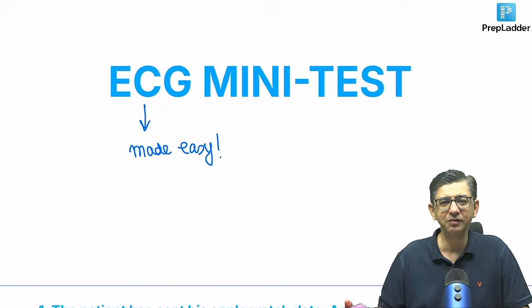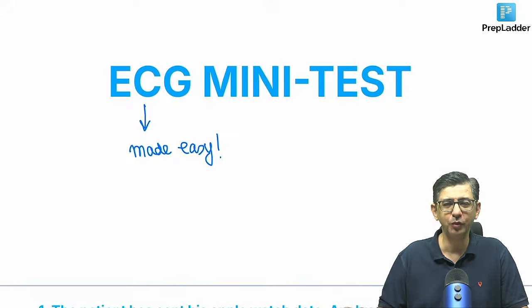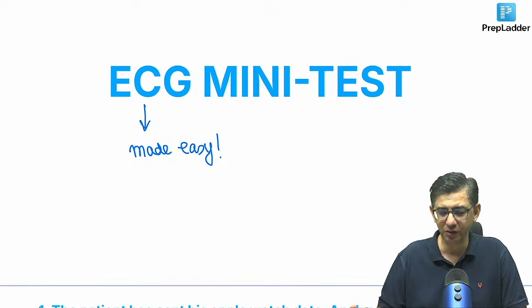So in ECG, we are gonna make it easy. The squiggly, wiggly lines are gonna be analyzed by you like a pro champion, so that you are able to analyze them in the real world as well as when it comes to multiple choice questions.